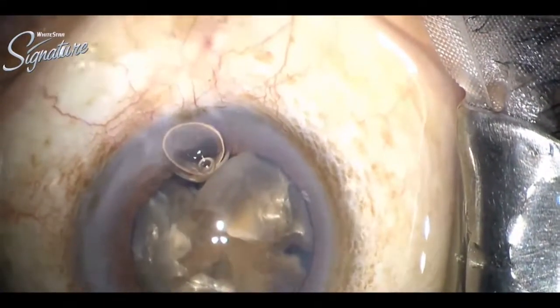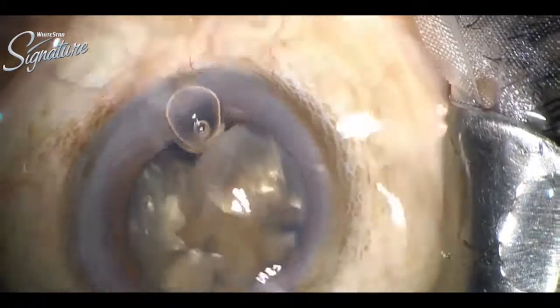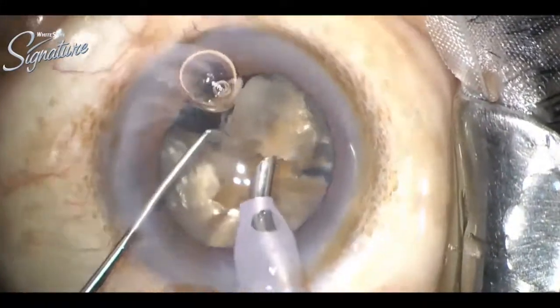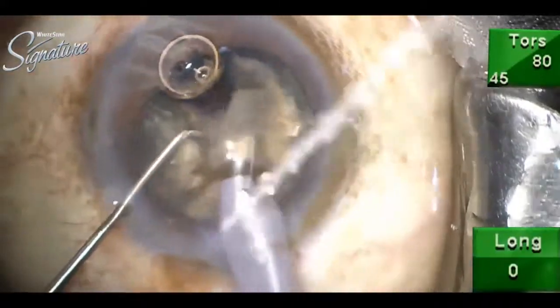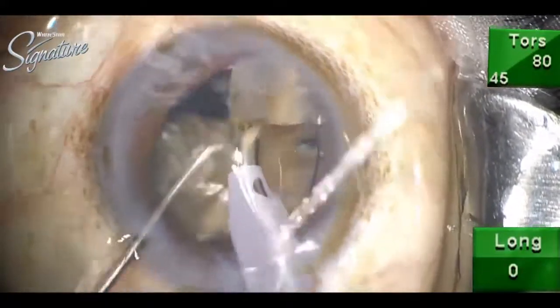The followability is maximum and there is no occlusion. Even if it is against the posterior capsule, you can see the followability is good and there is no fluid turbulence.